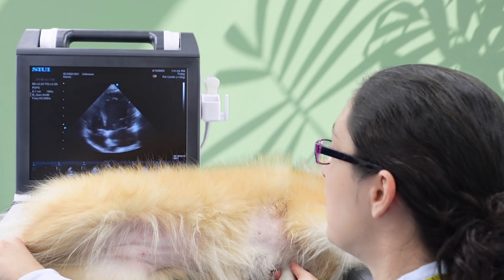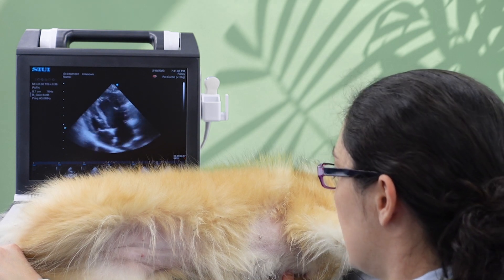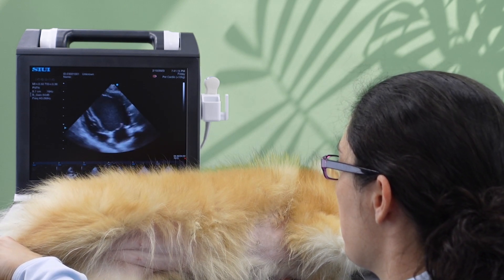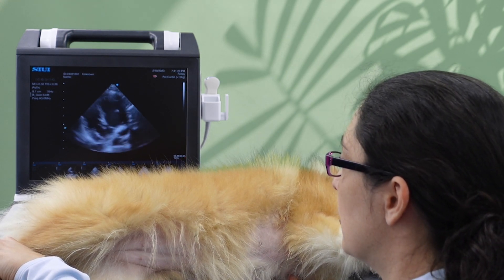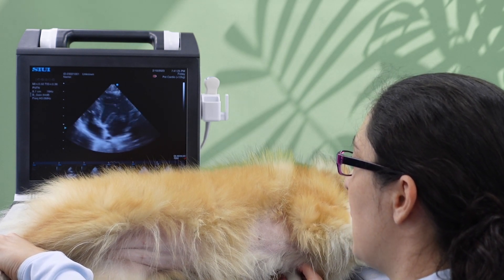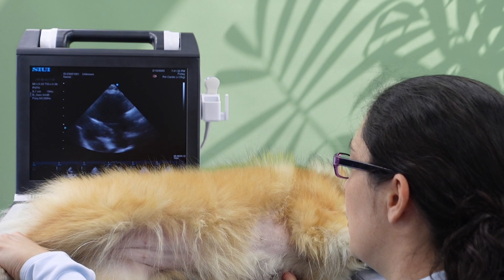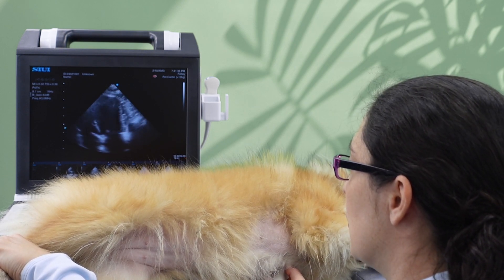To summarise the most common problems: an off-axis image like this can be solved by simply tilting like this. A foreshortened ventricle where you're too high up on your patient — up one or even two rib spaces cranially — and your ventricle is looking like this with the apex coming in on itself, the solution is to slide down a rib space or two as far down as you can really get to make that ventricle nice and long.